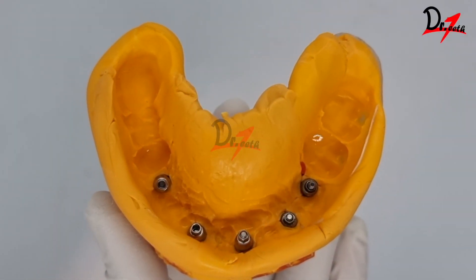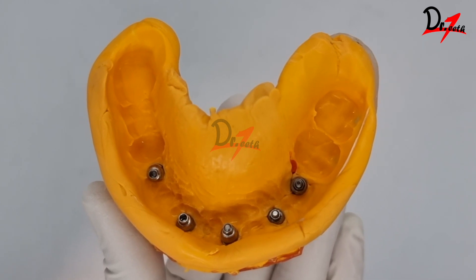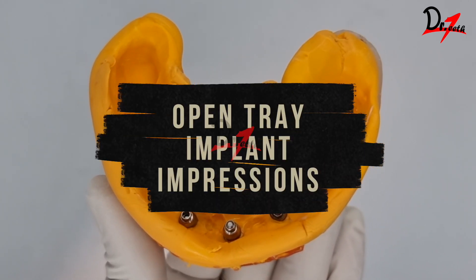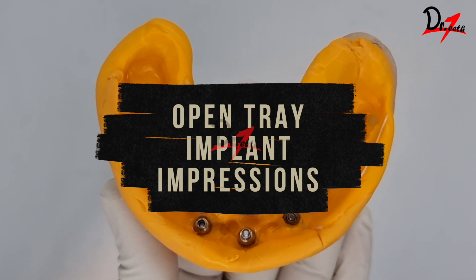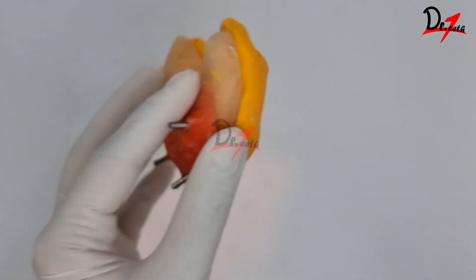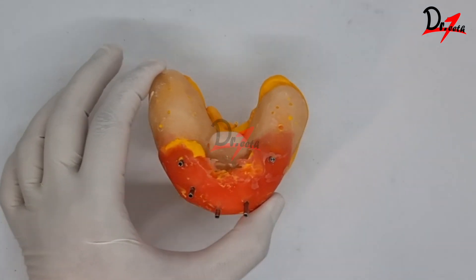Hello everyone, assalamualaikum, welcome back to Dr. Teeth. In this video we are going to see a demonstration of the open tray impression technique in cases where we have multiple implants or in cases where we have implants that are not parallel, so in those cases we need to make an open tray impression.